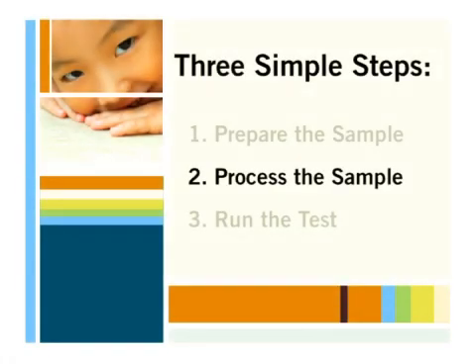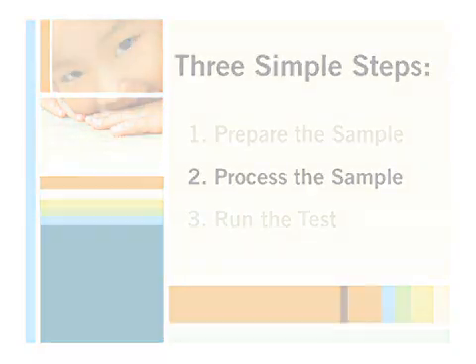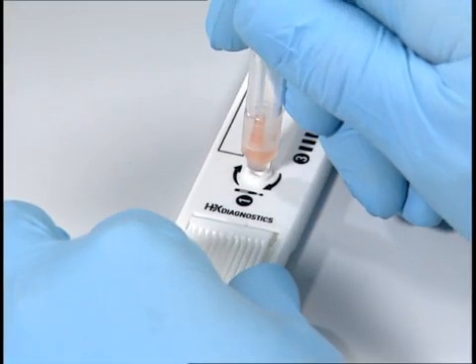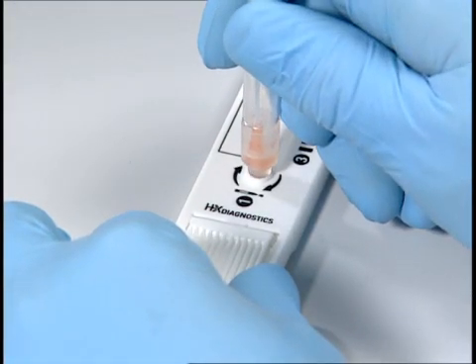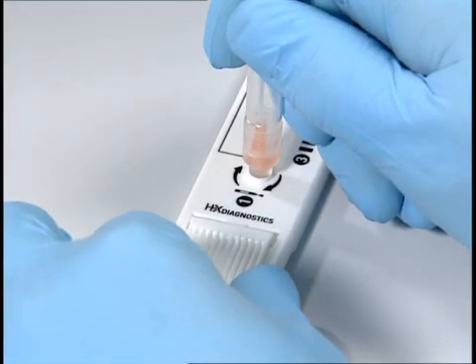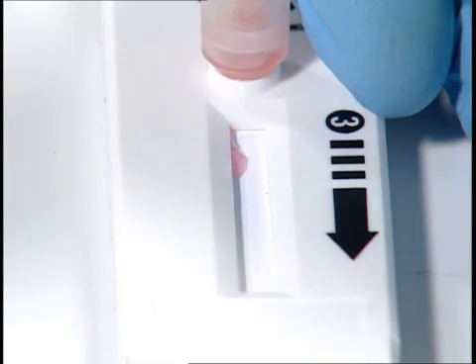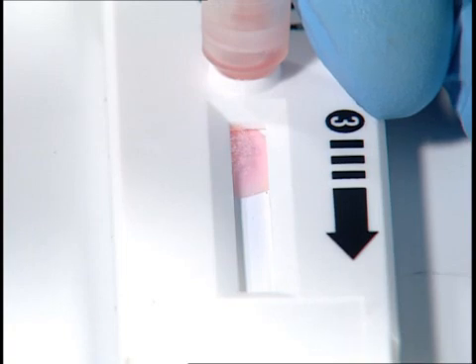Second, process the sample. Insert the tip of the sample reagent assembly into the cartridge. Listen for an audible click — the cartridge window will change color.